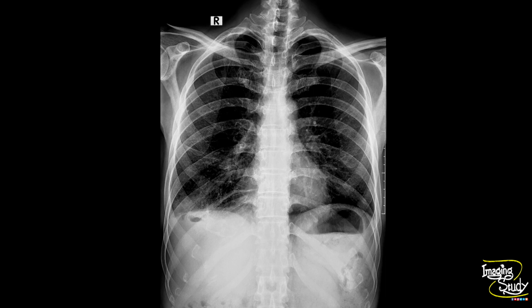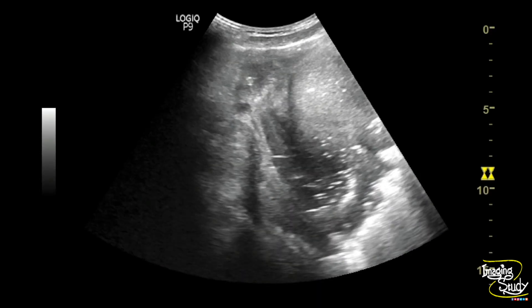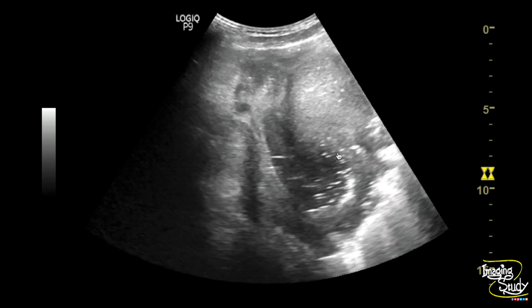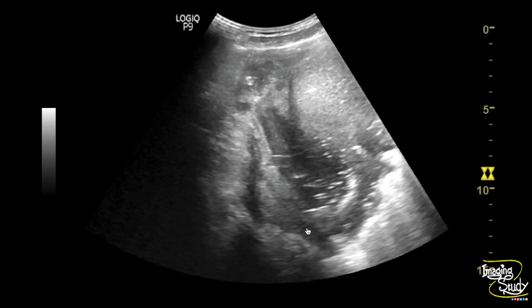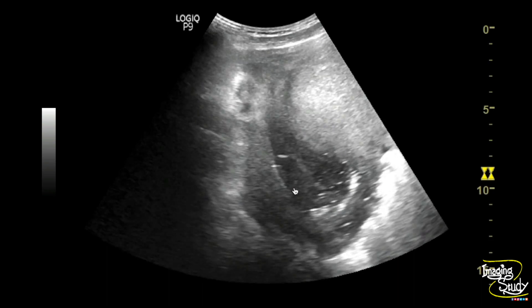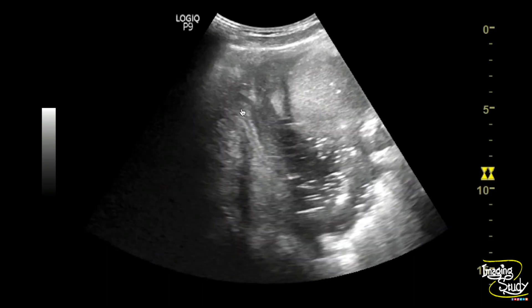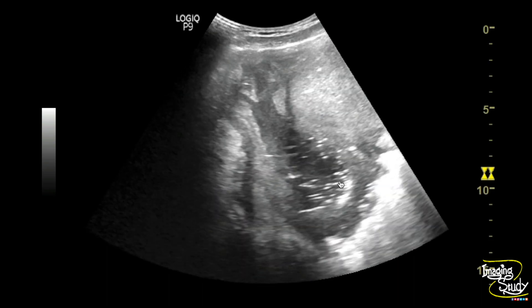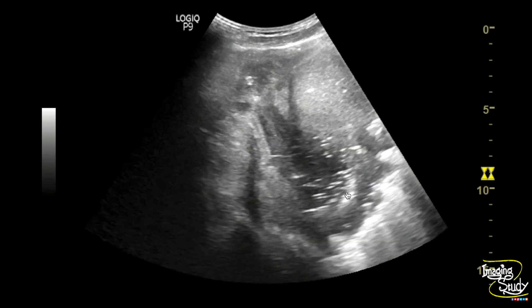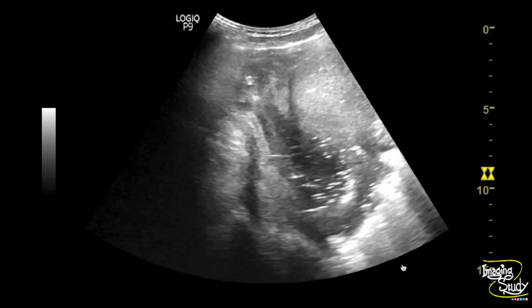Let's see what we have on ultrasound. Here you can see the right hypochondric region on ultrasound, and a heterogeneous thick-walled area is noted between the liver and diaphragm. You can see it contains some heterogeneous collection. There are some echogenic foci also noted, indicating air within.